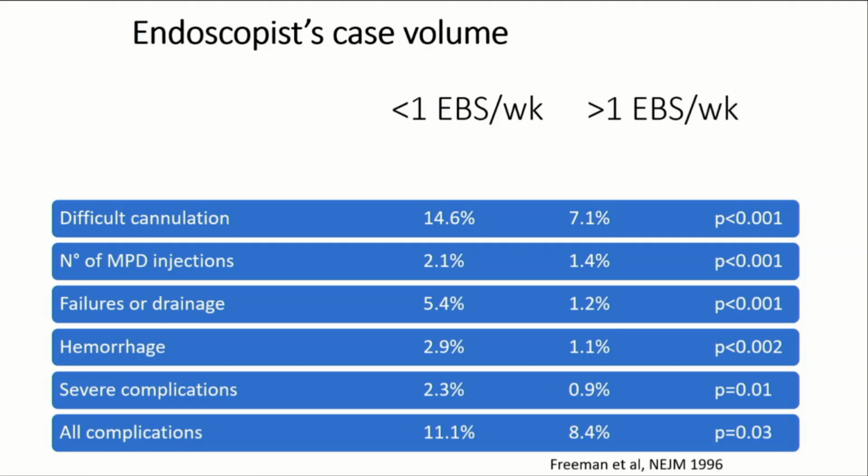This is an old study from 1996. I believe this may be applicable in the early phase of the training of ERCP performance. I believe that after a certain number of ERCPs, maybe more than 1,000, 1,500, or even more, these numbers may not be applicable. We should not forget that if these numbers were applicable, the majority of the doctors in the private sector, at least in Dubai, should not perform ERCP. And we should have left it only for the public hospitals.